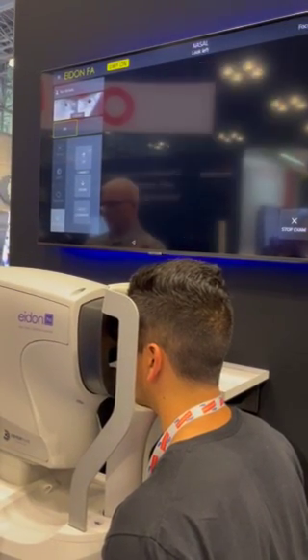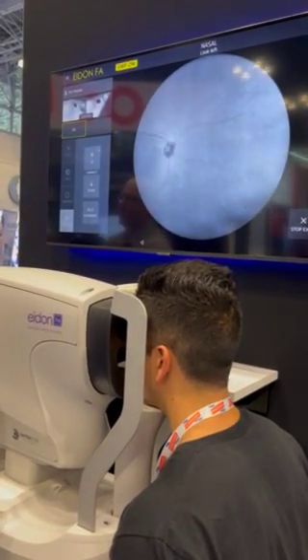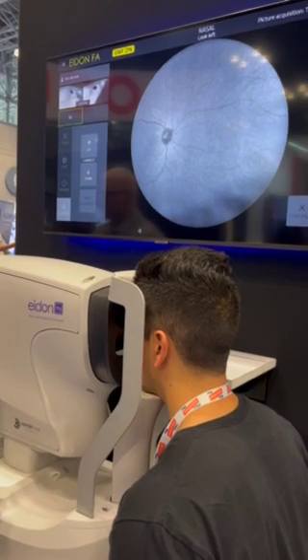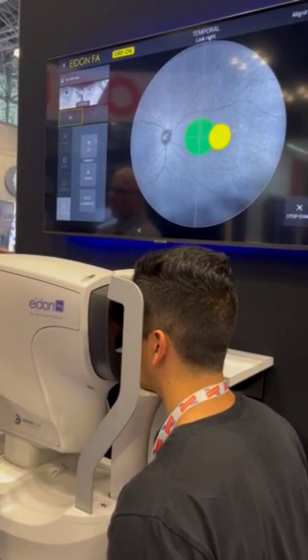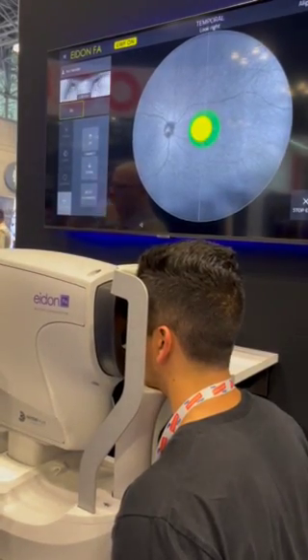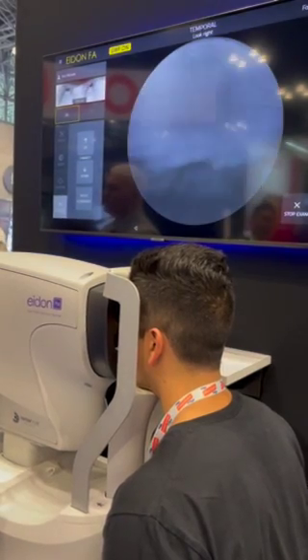Just find that green light — same thing. When you hear the beat, just keep your eyes wide open. So now one more image: you're going to look to your right, and that green light is going to be inside the system itself. Just look straight ahead; when you hear the beat, keep your eyes wide open.